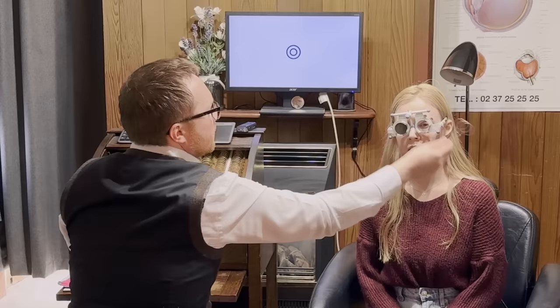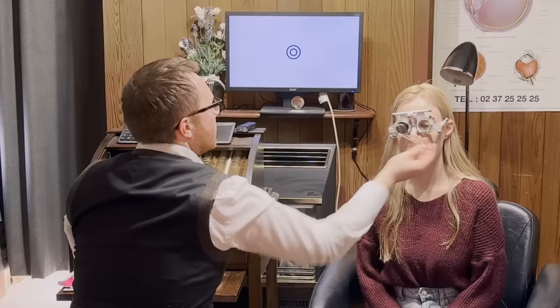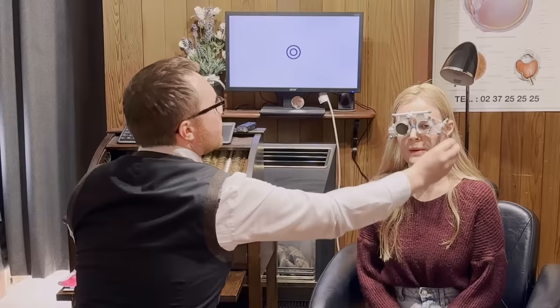Yeah. And if we have a look. Number one or number two? Two. And number one, two are about the same. So one, two. Two. And if we do the same again, so rounder and clearer with number one, number two are about the same. So we've got one, two. One is slightly better.